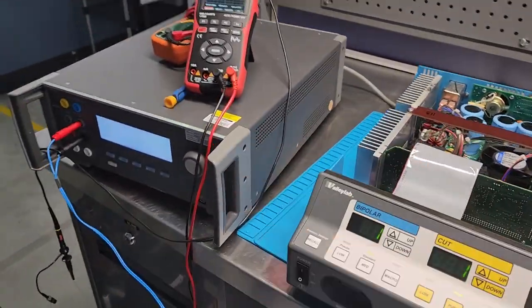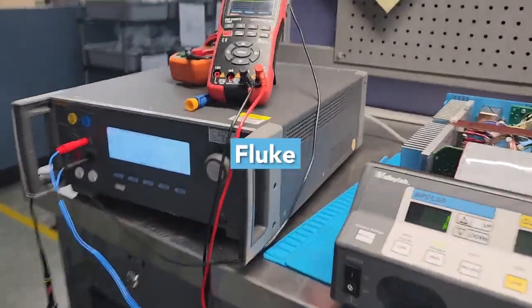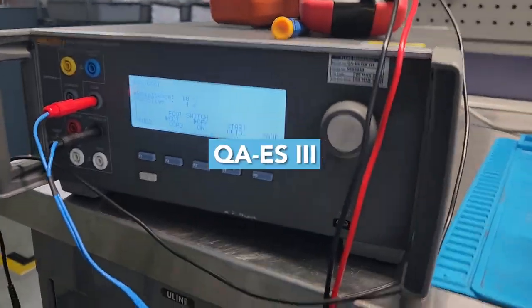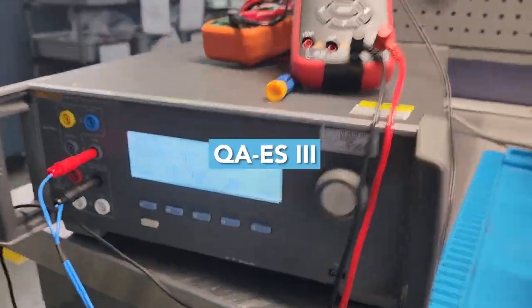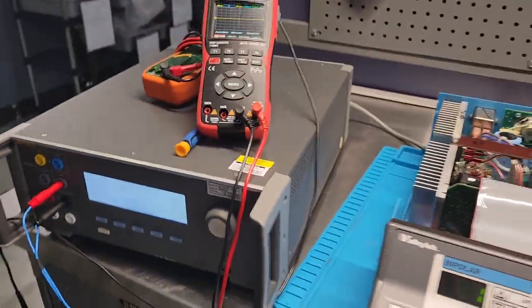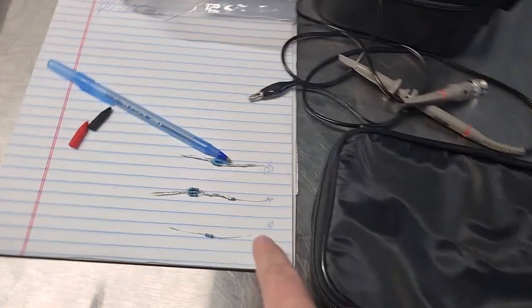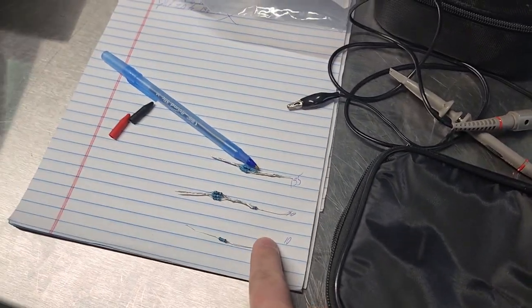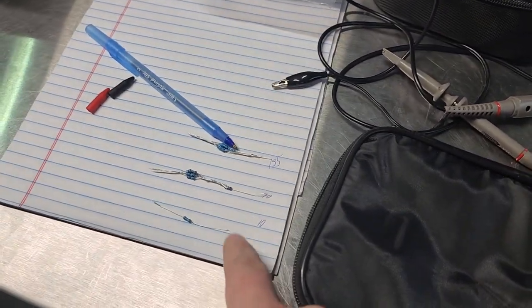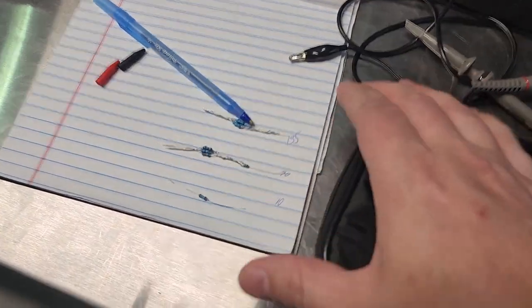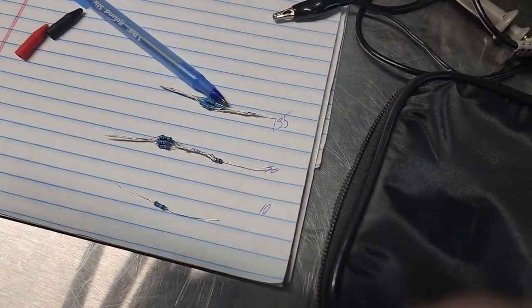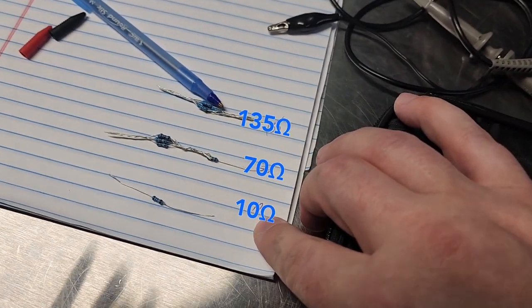And today we're going to be using the Fluke QA ES3, which actually makes this calibration way easier than the way I used to do it. In my other video, I did it with a set of resistors. You can see I've got the resistors set up in the network.